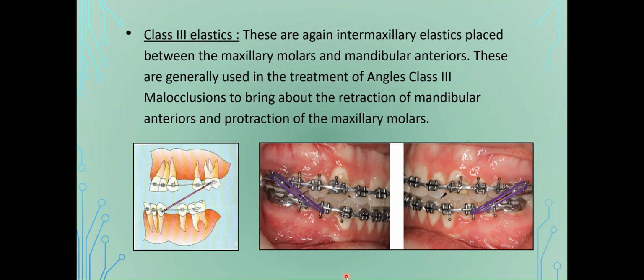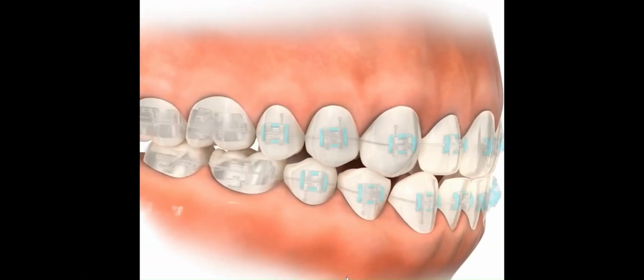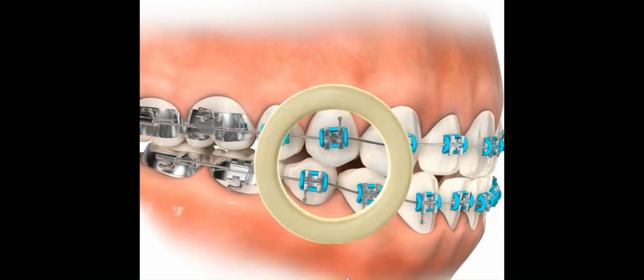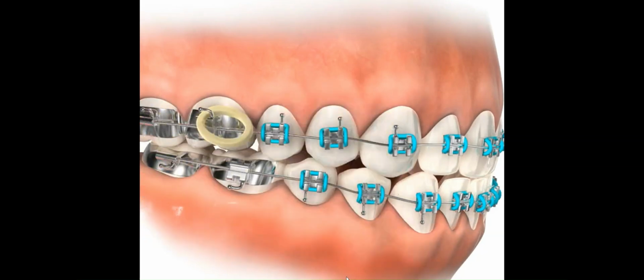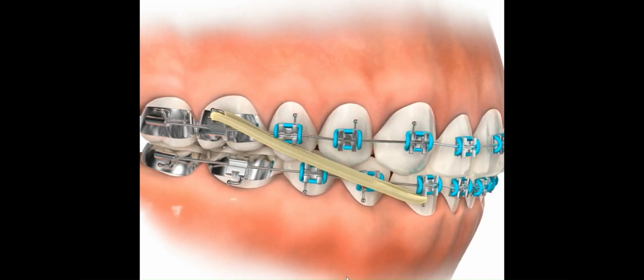Class 3 elastics. These are intermaxillary elastics that are used for the treatment of Angle's class 3 malocclusion. The elastics are worn from the maxillary molar to the mandibular anteriors to bring about retraction of the mandibular anteriors and protraction of the maxillary molars.